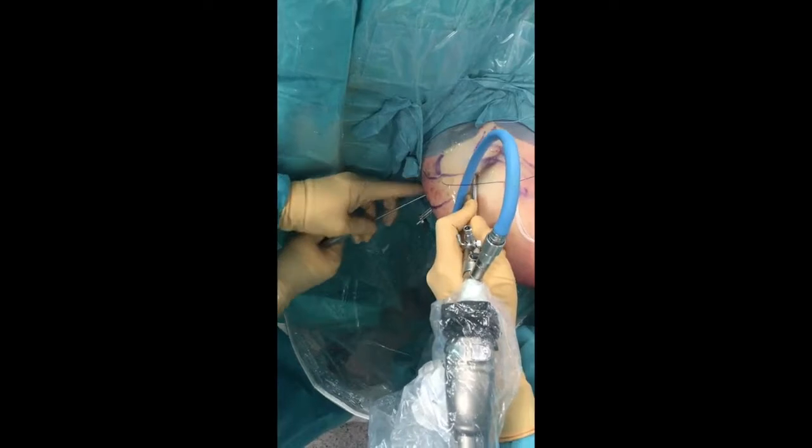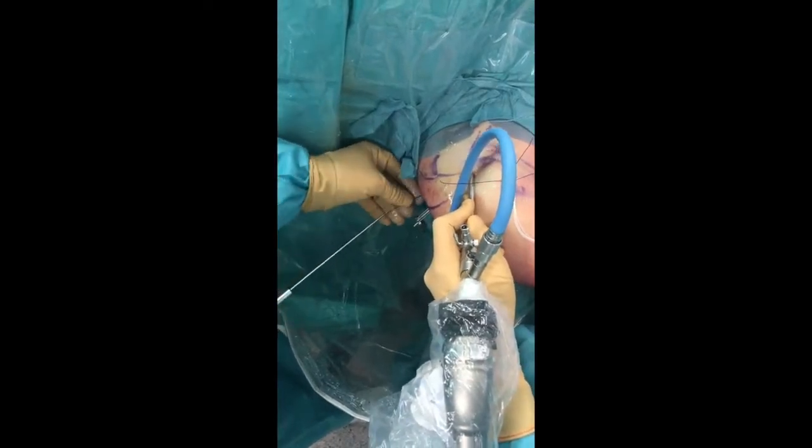The bone-linked sutures are then passed through the glenoid tunnel once the drill cannula is removed, and these are retrieved posteriorly.